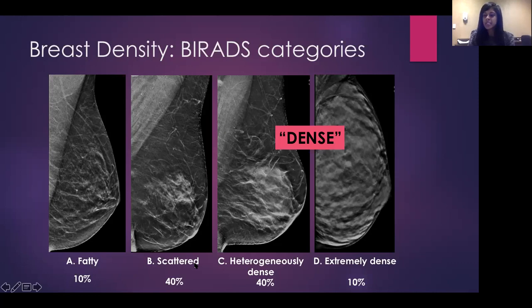But determining breast density can be somewhat complex. It is most often determined subjectively by the interpreting radiologist. At Charlotte Radiology, we also do use software. It's called Volpara, which determines the mammographic density volumetrically. So this does give us a more objective, quantitative interpretation, but this is not always perfect or reliable. So it's ultimately decided by the interpreting radiologist. So you may see sometimes that a woman's density will switch from B to C because they fall somewhere in the middle, and it just depends on who reads their mammogram that year to decide.